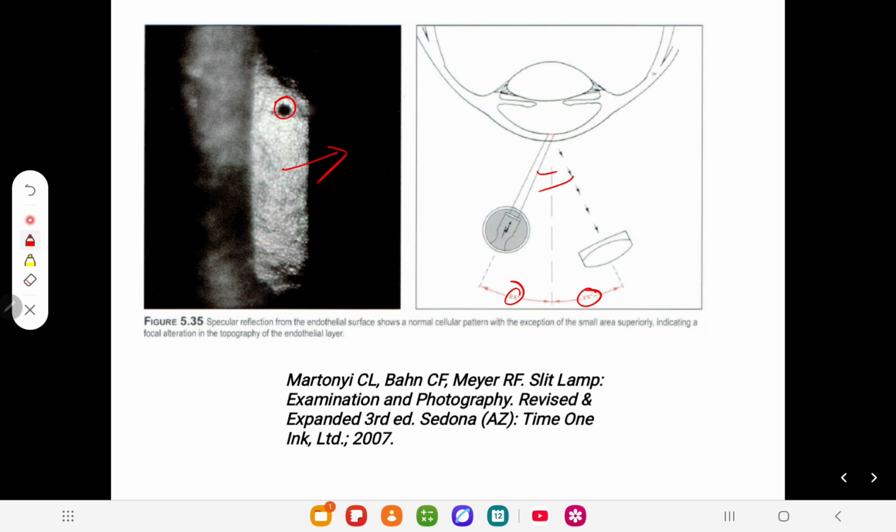But at this particular area, light is reflected, but not towards the eyepiece, it goes away in another direction, like this. So that's why you don't view light from that particular point, because that point does not follow the specular reflection, and that's why you always see black over there. Okay, that's very important. Why do you see black? Because no light is coming from that particular area to your eyepiece. It's very simple.